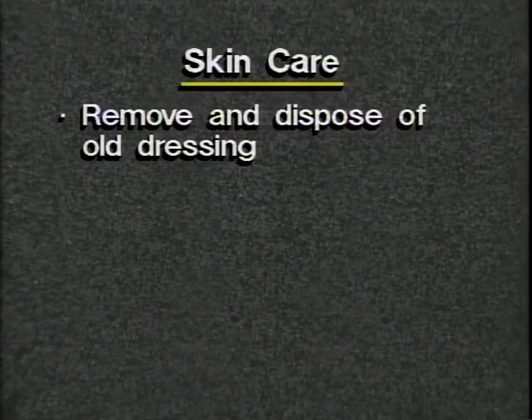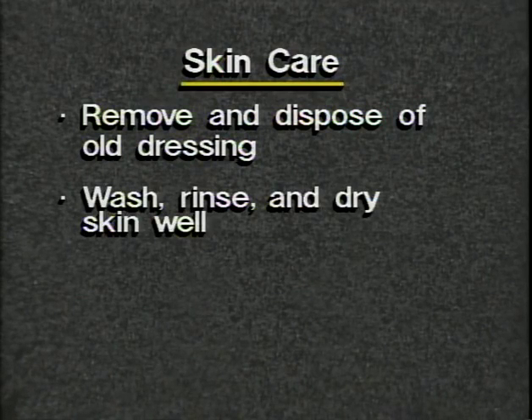For a gastrostomy or jejunostomy tube, the patient will also need skin care at the insertion site or stoma. If the insertion site is not yet healed, the nurse will probably perform the dressing change. When the site is healed, you may be assigned to cleanse the skin. Follow these steps. Remove the old dressing if one is used. Dispose of it properly and wash your hands. Use a clean cloth, mild soap, and warm water. Wash with a circular motion, beginning next to the insertion site, also called a stoma. Do not pull on the tube. Rinse the skin with warm water and dry well.